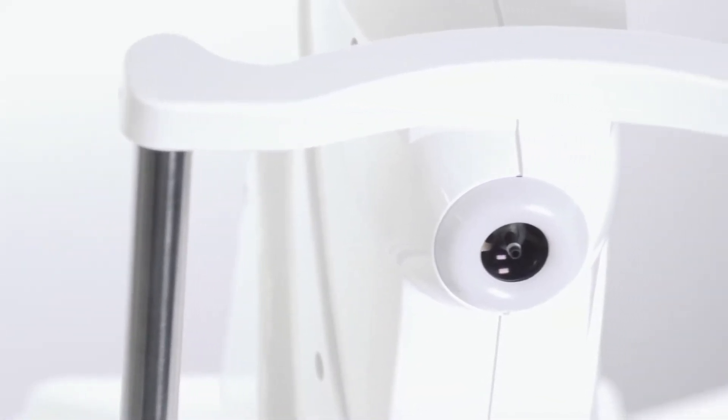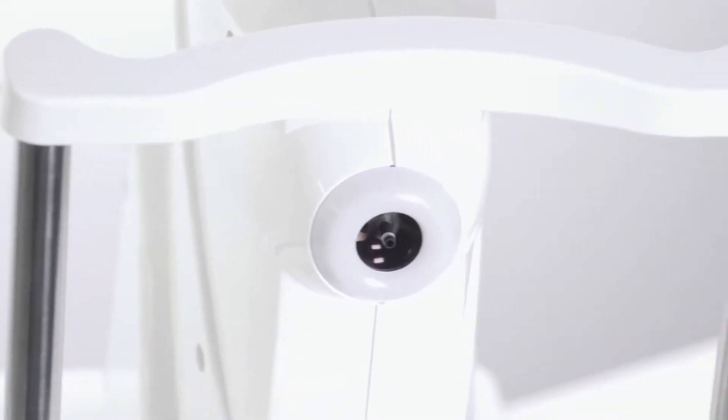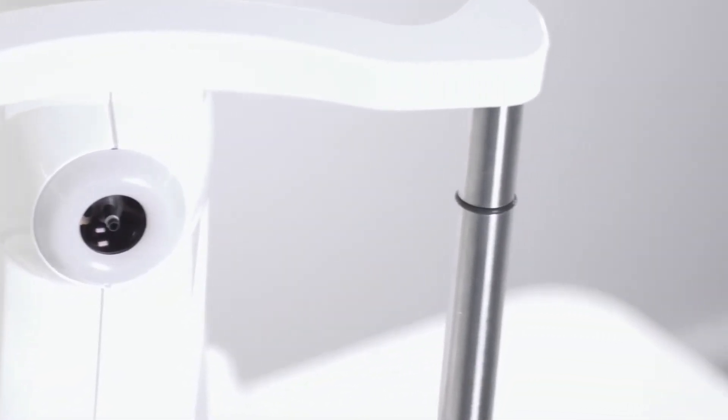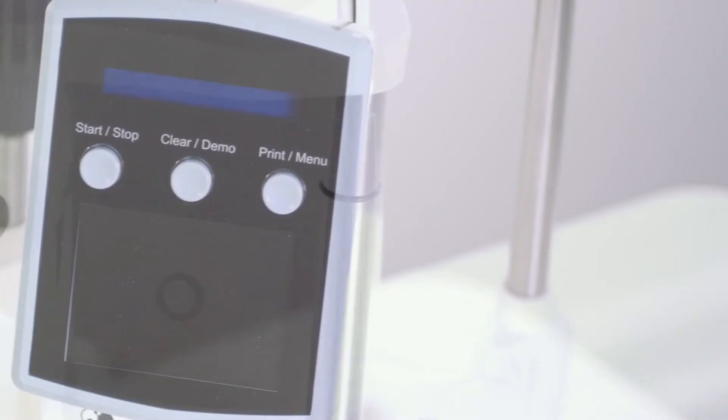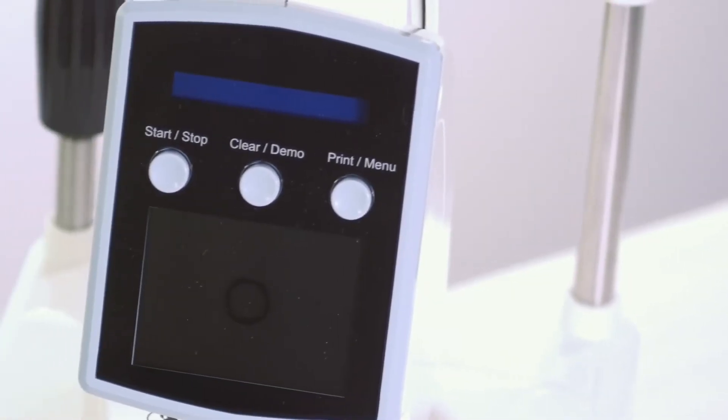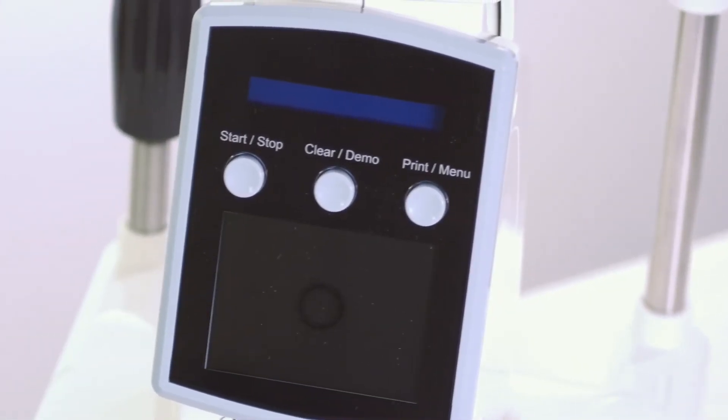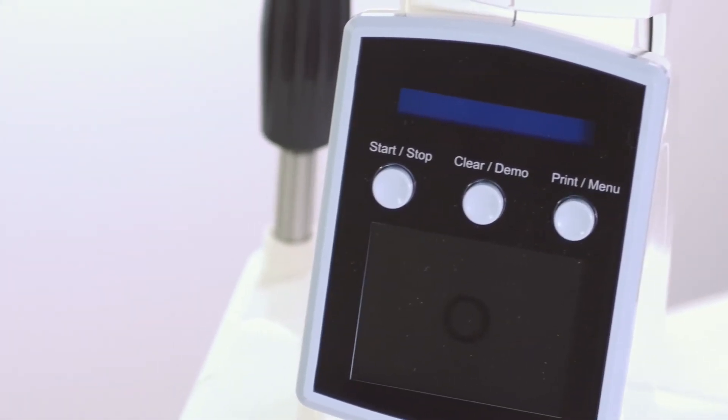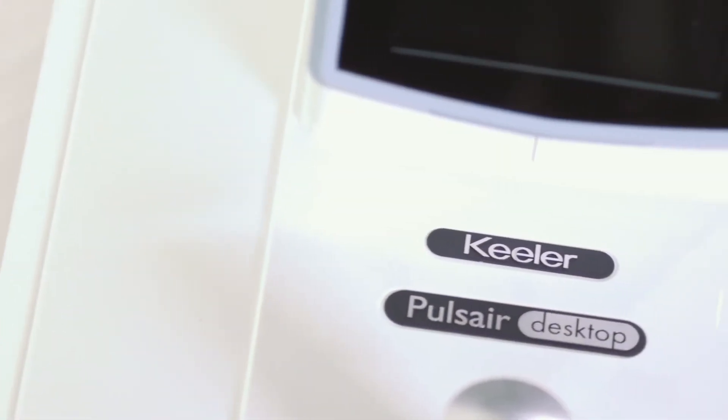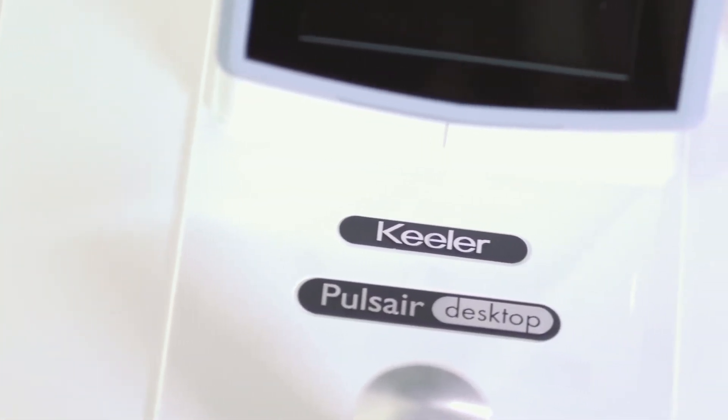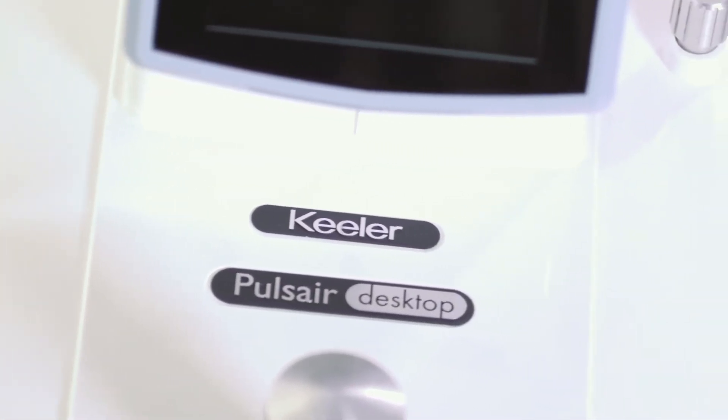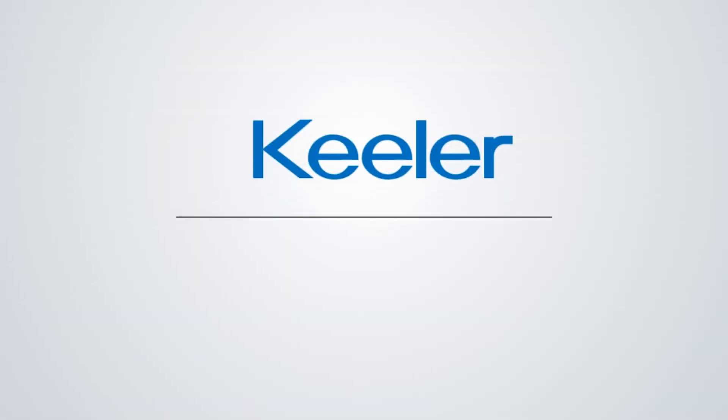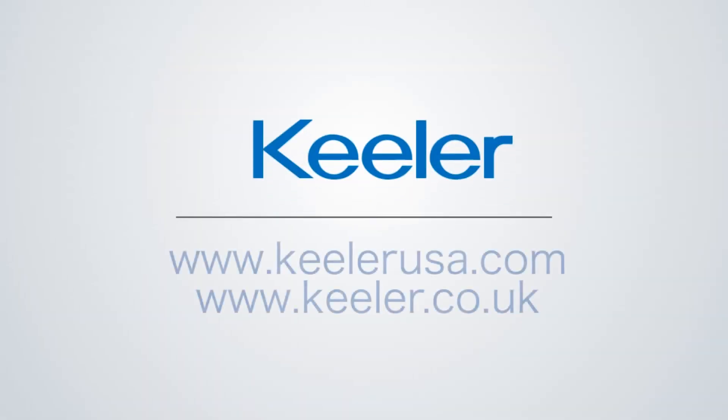The Keeler PulseAir desktop delivers fast and accurate readings with a slim profile that puts patients at ease. For more information on the PulseAir or other Keeler tonometers, please visit our website. Our customer service team is dedicated to helping in any way we can, so give us a call if you have any additional questions.